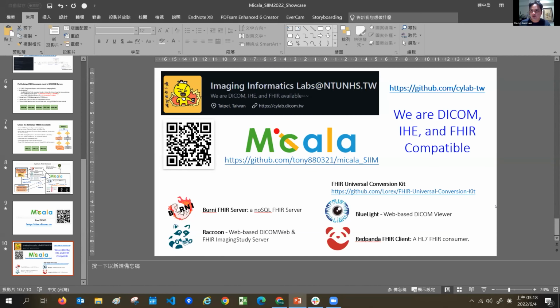I think the main users will be researchers because many hospitals in Taiwan are building research databases, especially for the medical imaging archive. So they will want to systematically collect all of the clinical data, including reports and imaging, from the hospital. So the documents need to be structured and standardized. So perhaps FHIR will be a proper solution to collect all of the clinical data. Of course, DICOM is obligatory because 99% of hospitals are on the DICOM format.